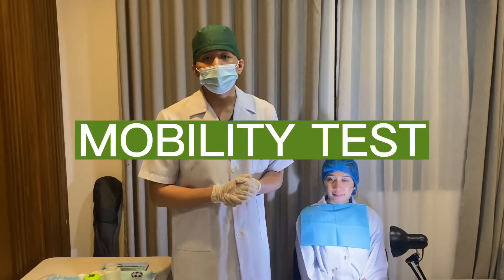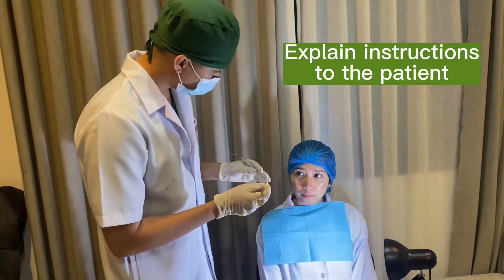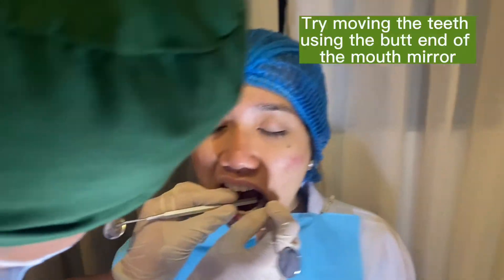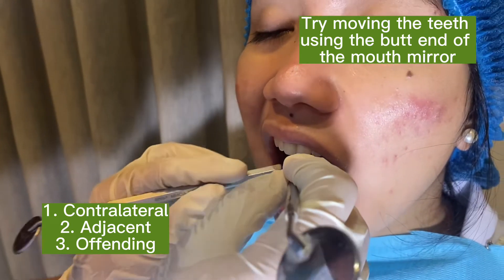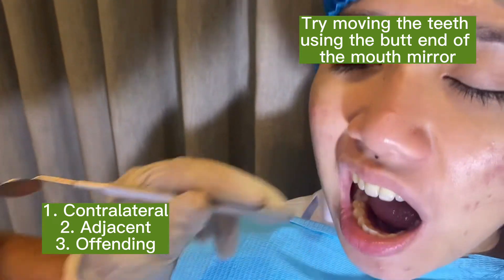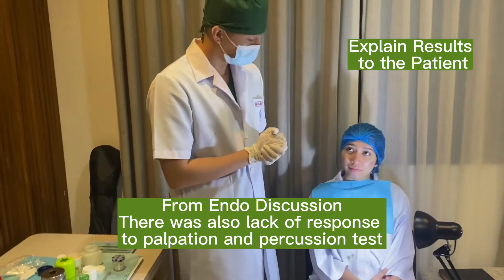The last test I will be doing is the mobility test. I will be using 2 mouth mirrors. I will try to move your teeth to see if there is any movement — 1st degree mobility, 2nd, and 3rd degree mobility. So it's good. Your bone level is good and your surrounding structures are perfectly normal.